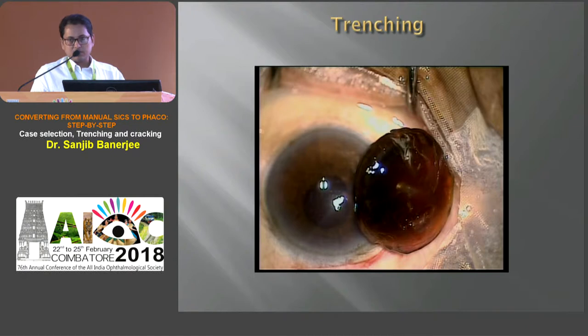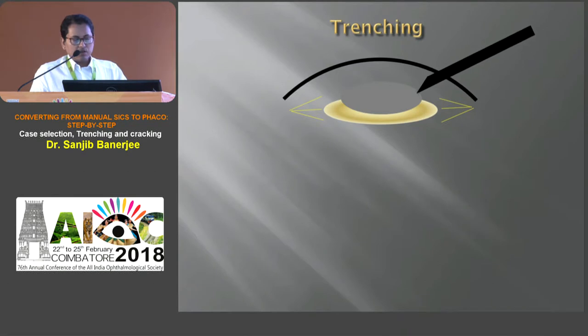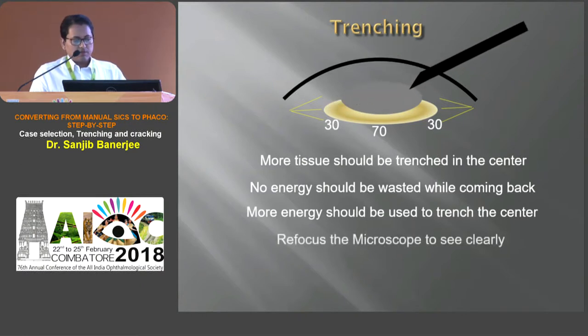The nucleus is thicker in the center. So while trenching, more amount of tissue should be trenched in the center. And while coming back, no energy should be wasted. More energy is to be used during trenching in the center of the nucleus. Every time, refocusing of the microscope is essential for seeing the posterior aspect of the nucleus very clearly.